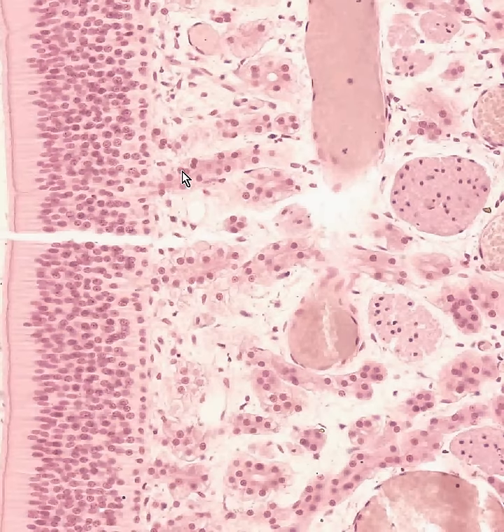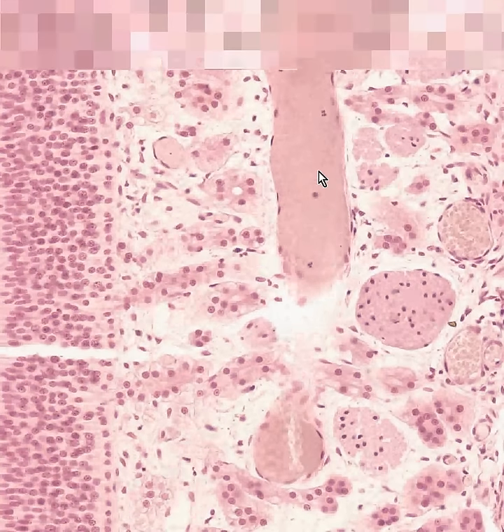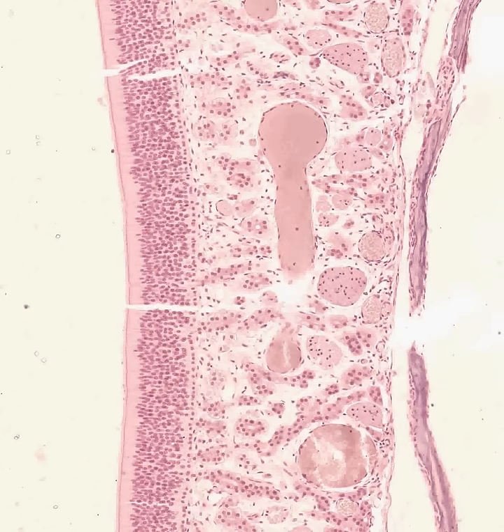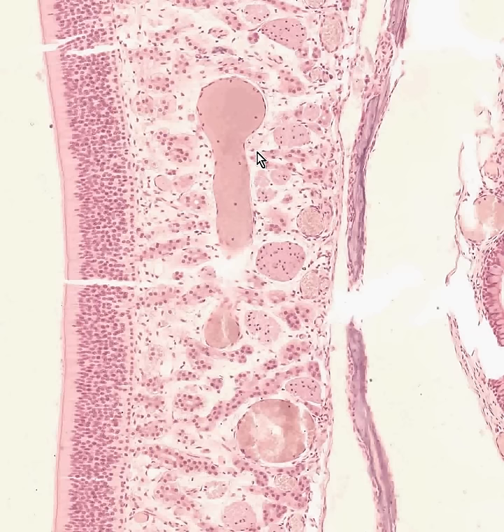Here are glands which moisten the nasal olfactory epithelium, because without the molecules dissolving, there can be no smell. And these glands, looking chiefly like serous glands, are called Bowman's glands. This epithelium, this tissue, this mucosa, or submucosa perhaps, in this area, is also very rich in blood vessels, especially veins, because this is where the air from the nasal cavity is actually warmed by these veins.